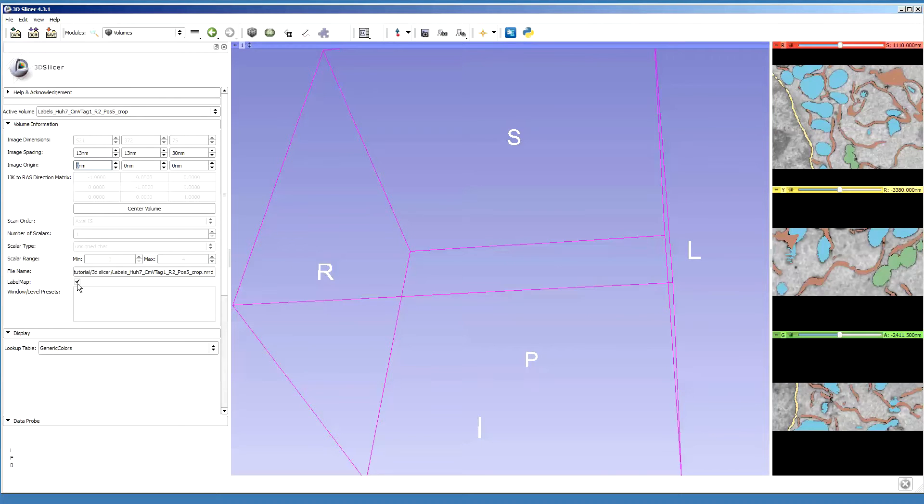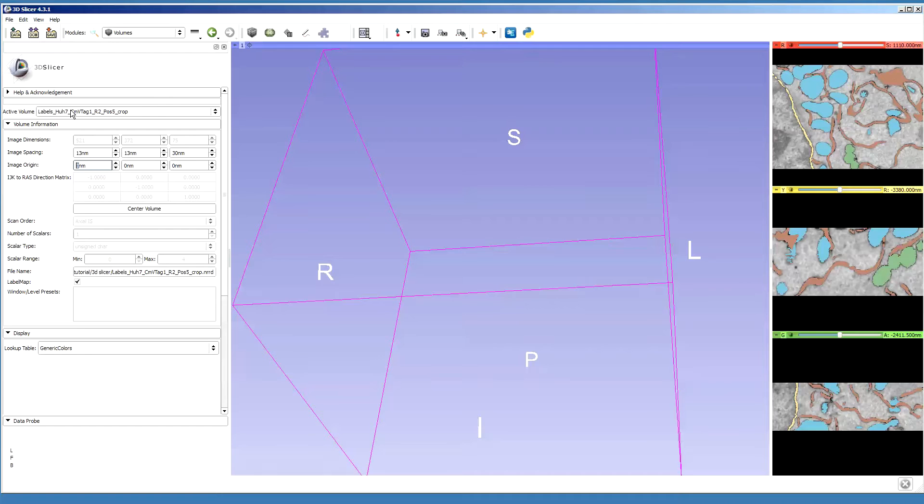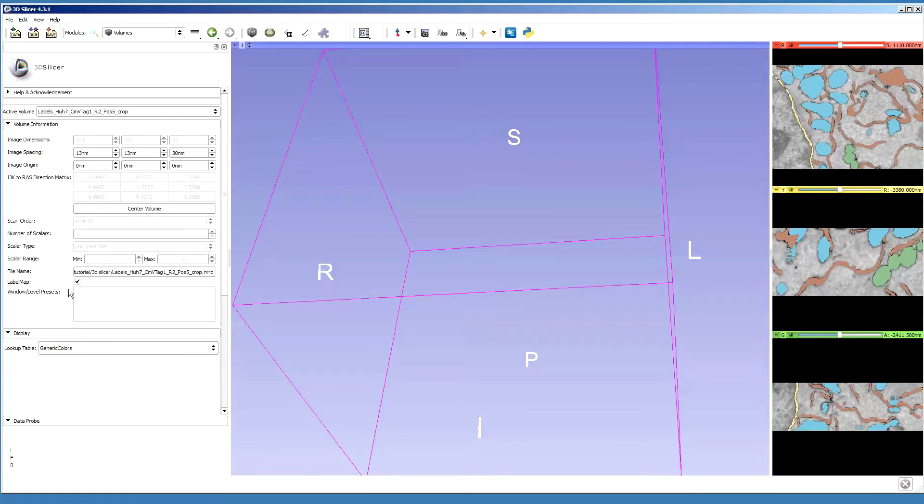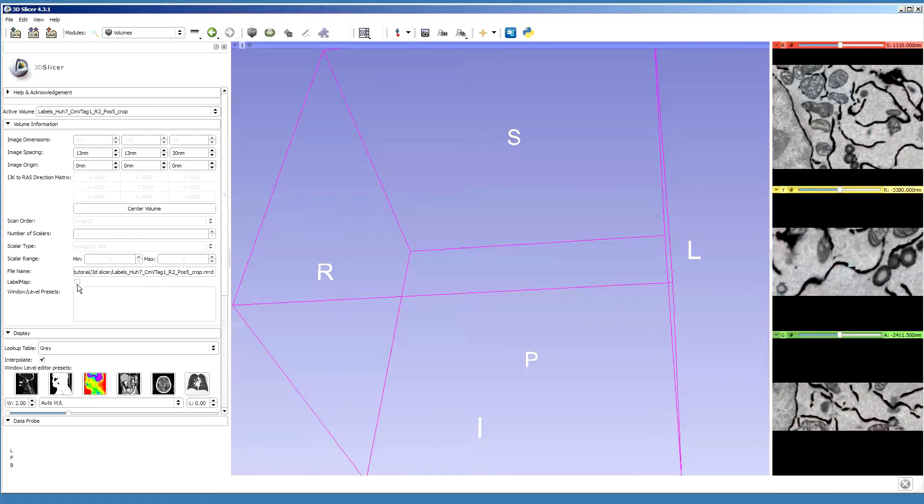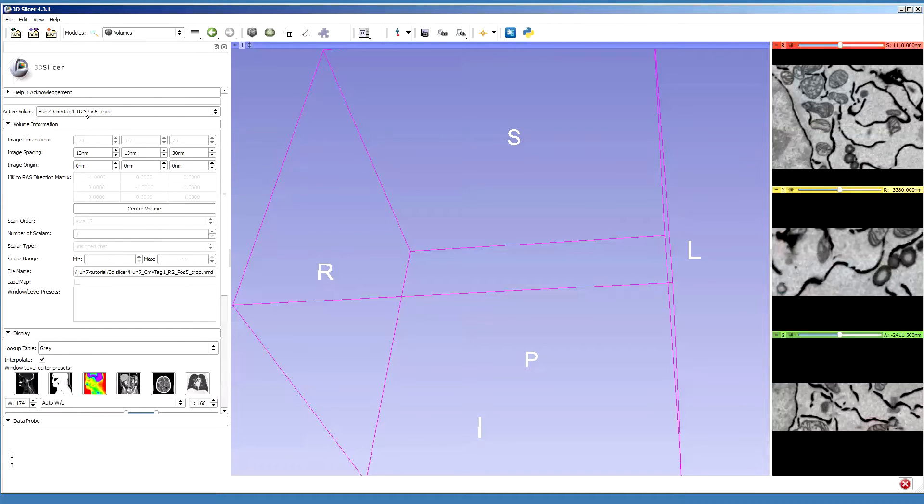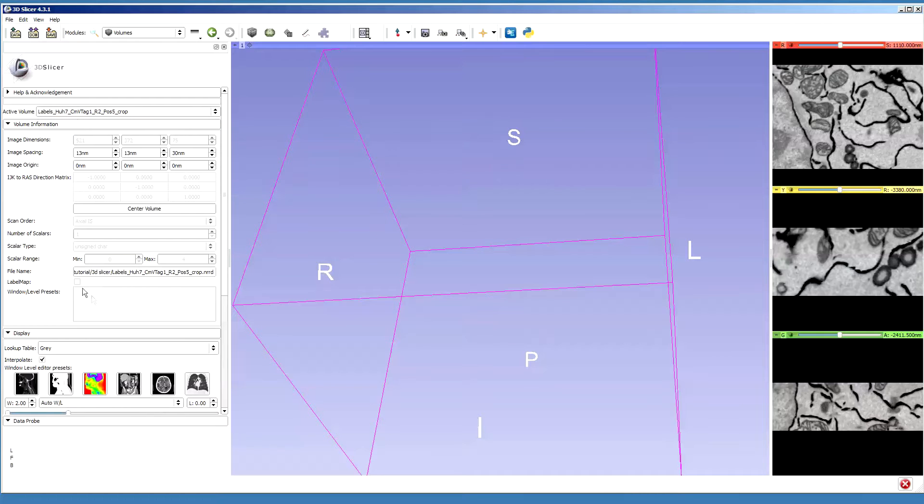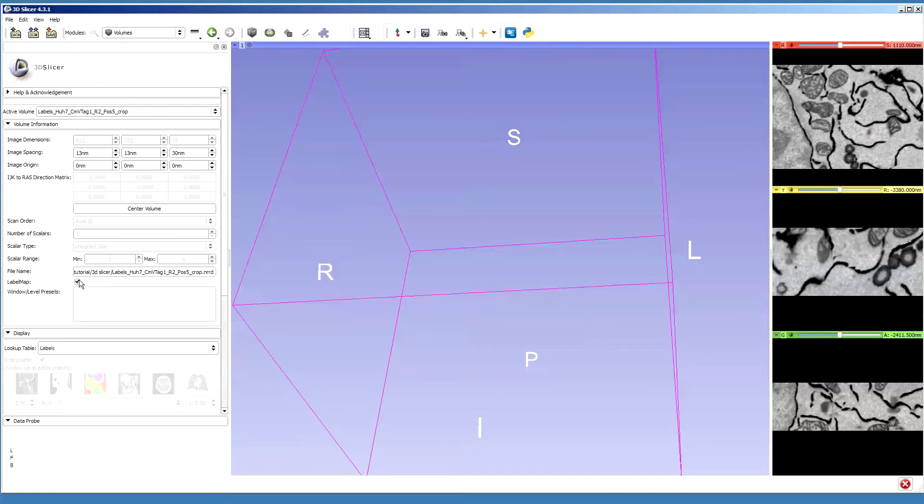Then I press this small third button to fit the view. One important thing here in this dialog is the label map checkbox, because it indicates that this particular volume is actually a model or segmentation model for the data. If I uncheck this, it will assume this as the data rather than the model, so it has to be checked.